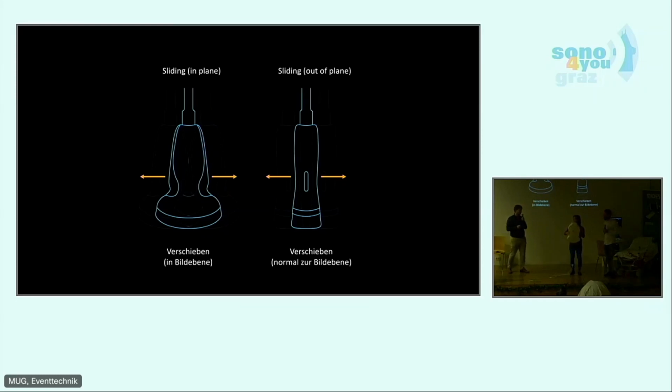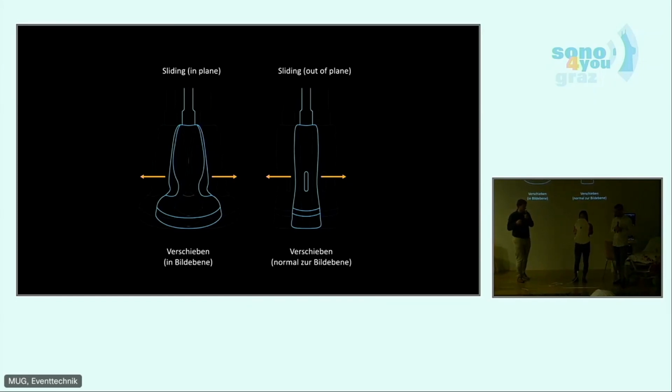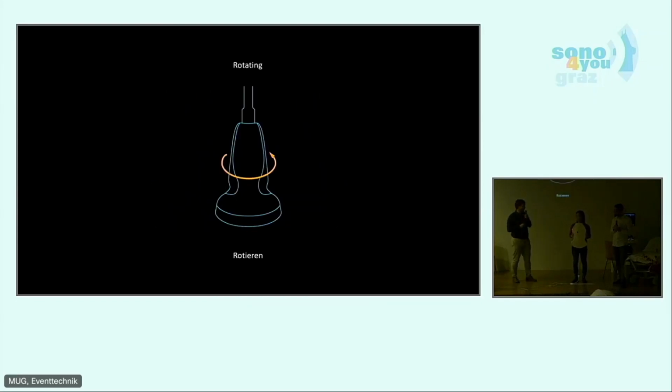Now we have 2 sliding movements. Just point downwards. The first sliding movement is in plane. So just go a bit to the left and to the right. Nice. Now a sliding movement out of plane. So a bit forward and a bit backward. You're already there. Our last movement is a rotating movement where we keep the probe like this, but rotate it along its own axis. I see it's kind of easy for you. So we are ready for level 2.